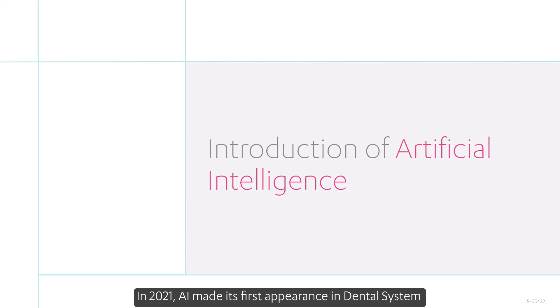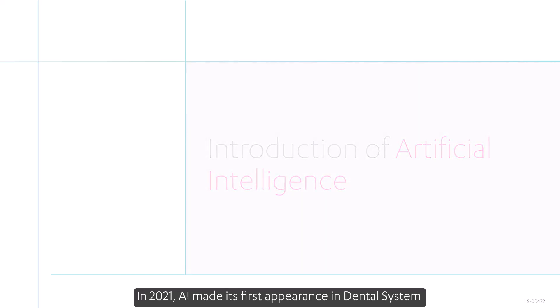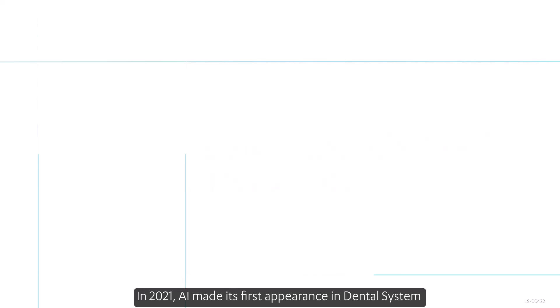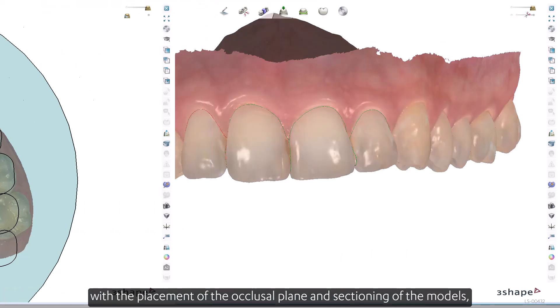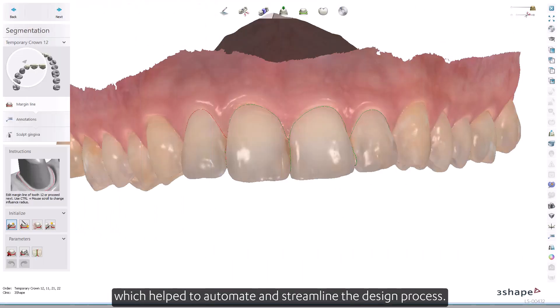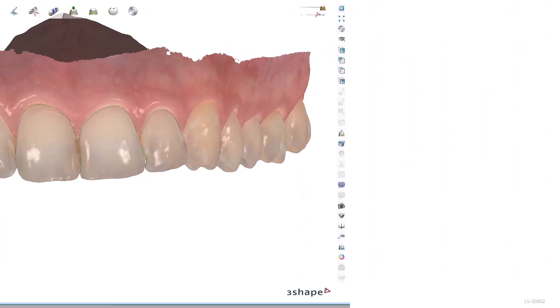In 2021, AI made its first appearance in Dental System with the placement of the occlusal plane and sectioning of the models, helping to automate and streamline the design process.